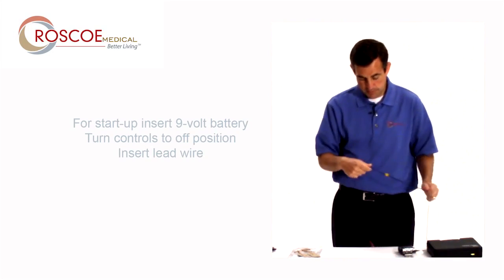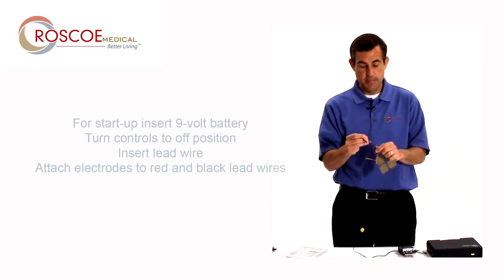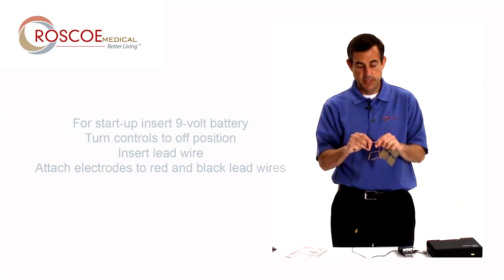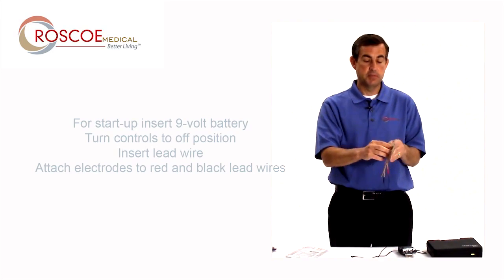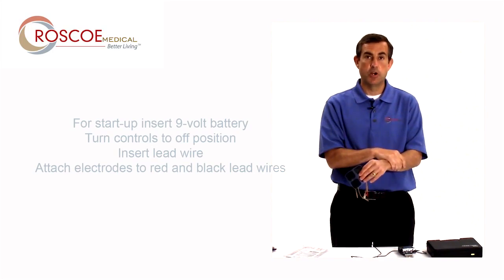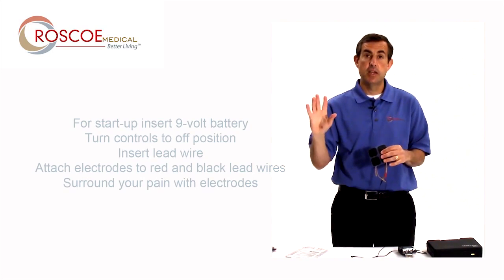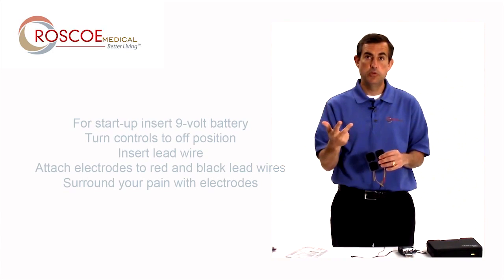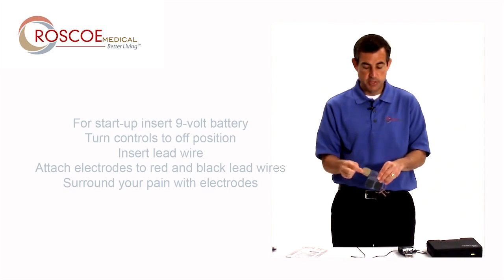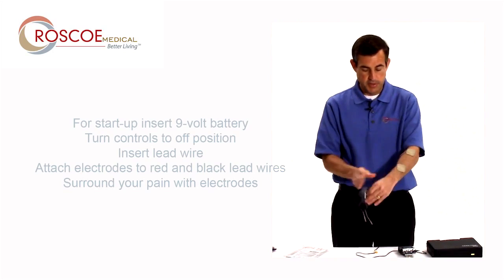The next thing I'm going to do is insert the red and the black tip of the lead wire right into the electrode. Then I'm going to take the electrode off its plastic backing and place it where it hurts. It's important to remember that you want to surround the pain — if it's a large area, use four electrodes and surround it; if it's a small area, use two and try to surround it. Today I'm going to use these two and say the pain is right in the middle of my forearm.